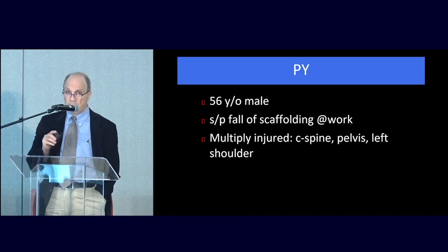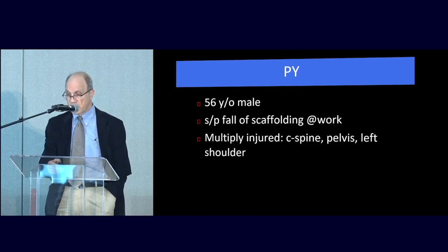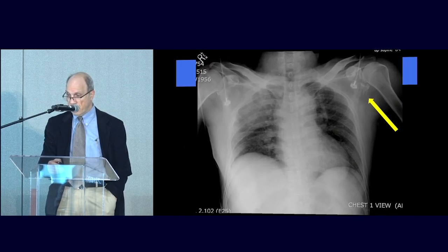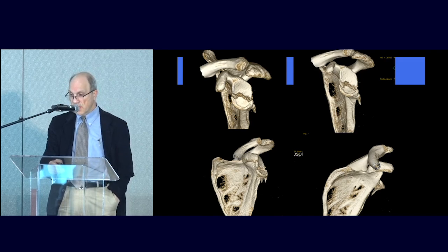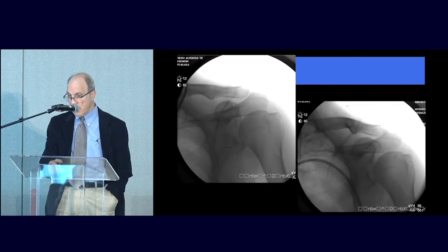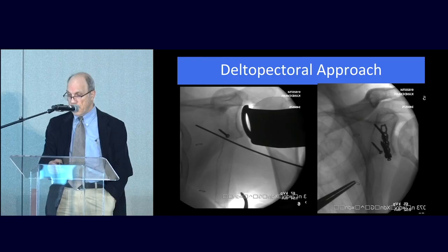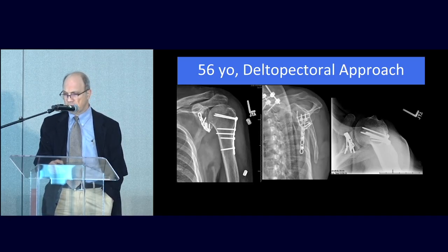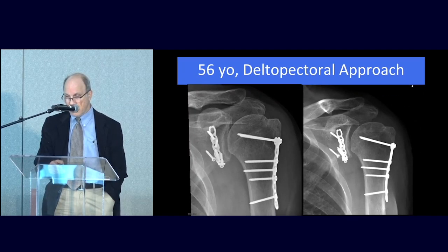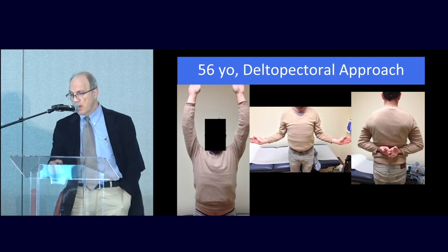So the deltopectoral approach is going to be mostly for anterior glenoid fractures, anterior inferior glenoid fractures, because going posterior doesn't make any sense. This is a 56-year-old, fall off a scaffold, anterior inferior glenoid fracture, significant displacement. This may cause subluxation. Again, the joint is not that terrible, but with that gap, I elected to do surgery on him, so that he doesn't end up with some kind of anterior inferior subluxation of the joint that may cause arthritis. So fixed through a deltopectoral approach. The non-displaced proximal humerus greater tuberosity fracture, I fixed it so that I can start range of motion quicker, not to worry about it. Still, I had some displacement of the greater tuberosity, but the glenoid stayed where it is, and it healed well. This was a good outcome too, at the end.